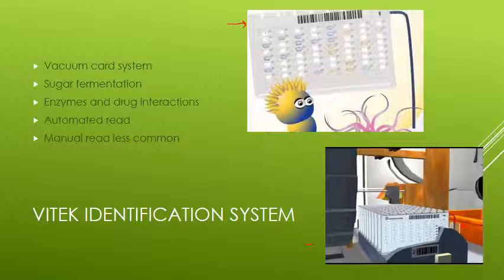follows. So once your card is filled, you put it in the instrument, and this, similar to the Microscan, the instrument will measure the time that that card was added, and at the appropriate incubation points, it will read the reactions. It can read the reactions at several different incubation points, so that if one test should have been read at 10 hours and the next at 14 hours and so on, it can keep track of that.